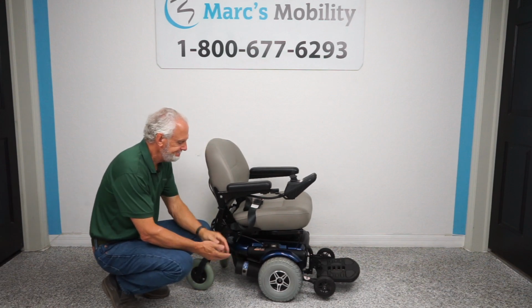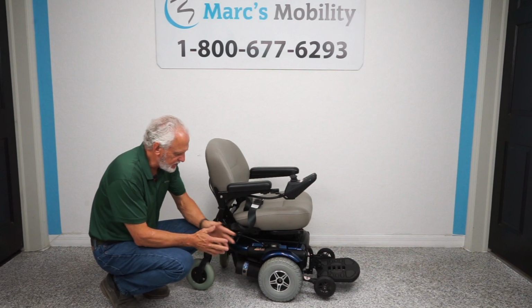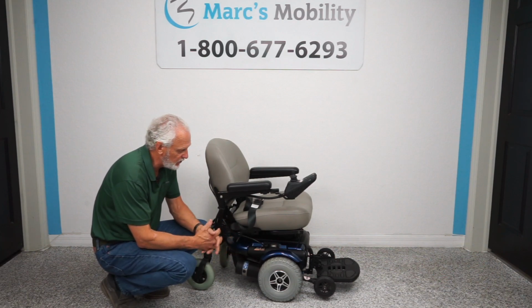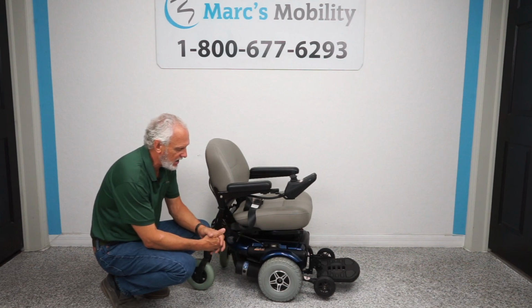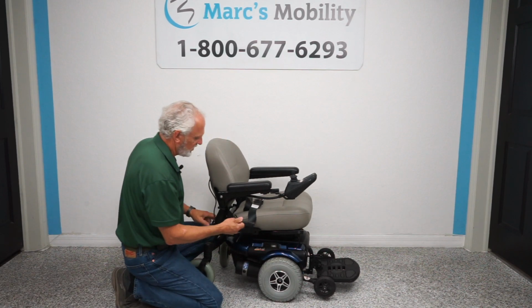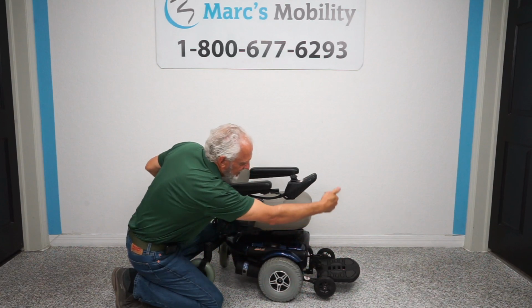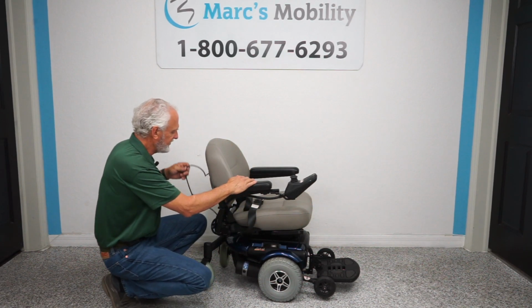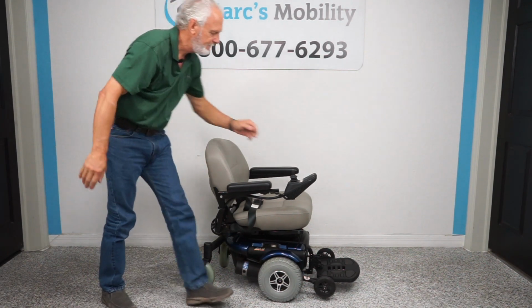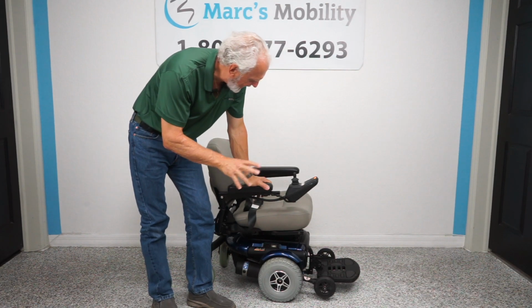Now, one more thing. These chairs are older models, so if the charger in here burns on you, let's just say it goes out, and they do go out because, you know, this chair's an older model, even though it's only got 9 hours, no big deal. You would just not use the charger here. You would just use an external charger. The charger sits on the ground. You can still charge it from the front, okay? So if that ever happens, you can do that, okay? There's 5 speed in this chair. This chair has a top speed of about 5 miles an hour.